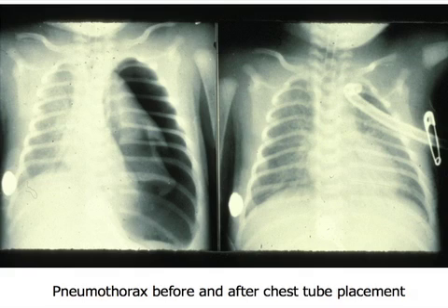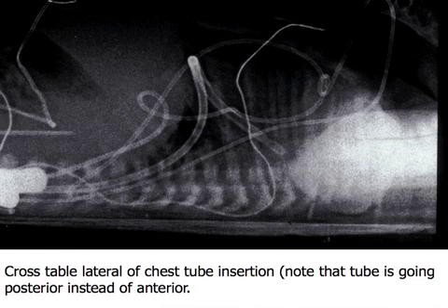Another pneumothorax, this time on the left side. What is this white area? That's the lung — this lung has hyaline membrane disease and is very stiff. A stiff lung is why, even though there's a lot of air here, you can still see the lung outline. Put the chest tube in, evacuate the air, and look at how the heart goes back. See how the heart was not even visible — it was completely shifted over to the other side. When you put the chest tube in, always check your cross-table lateral along with the flat plate.